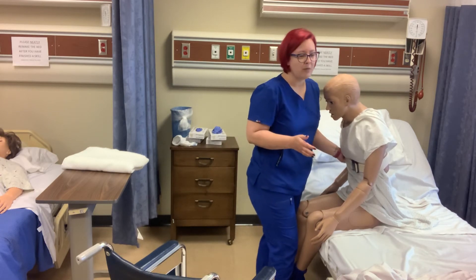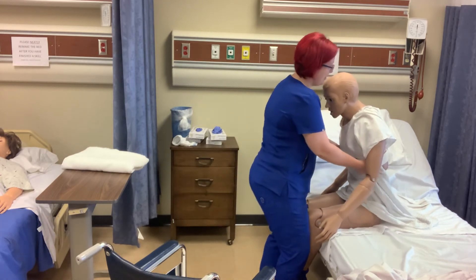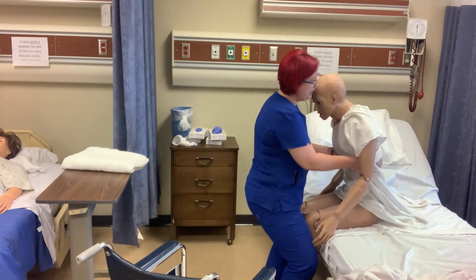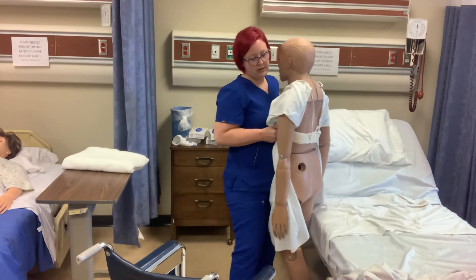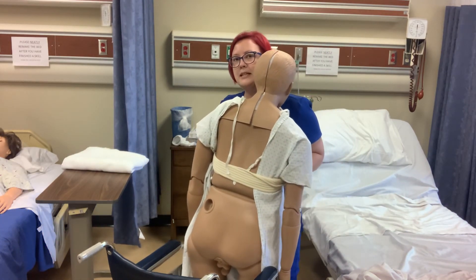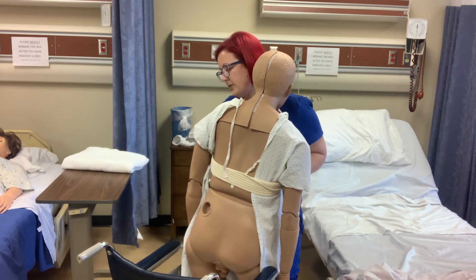Obviously a dummy can't help us much. Alright, on the count of three we're going to stand up, pivot and get into your chair. One, two, three. Okay, we're going to pivot. Okay, we're going to sit down — I'm using my knees and hips. We're going to sit down on three. One, two, three.